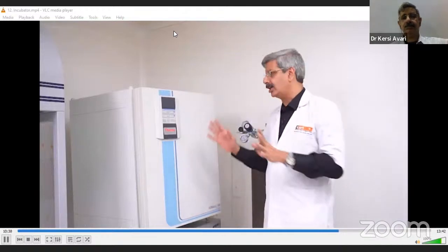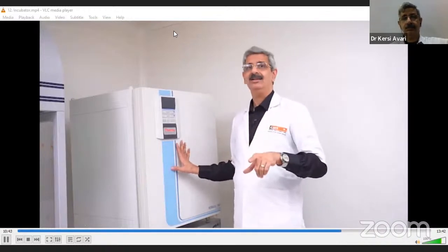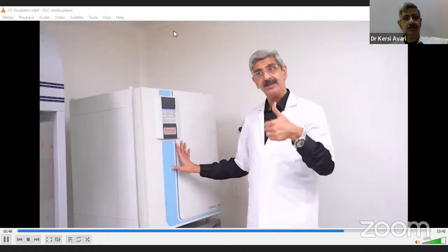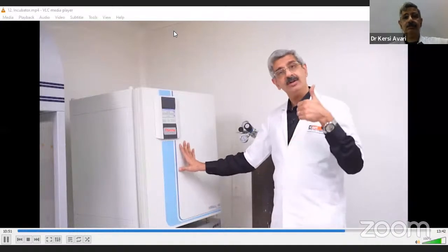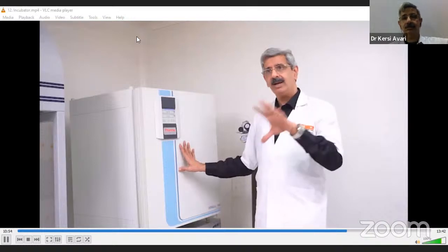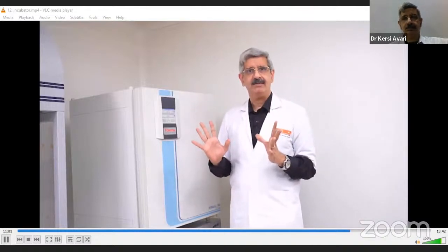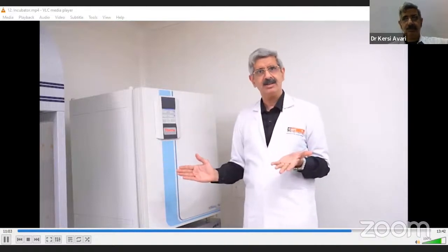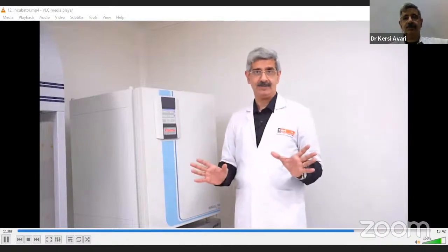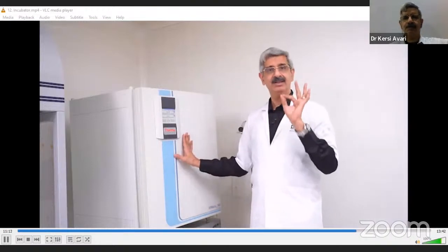Some people say, okay, I'll shut off the CO2. I will utilize a simple incubator, but still the temperature flux can have a toll on the sensors as such. Another thing that takes a toll is your electrical power surges. We don't mind power failures, but suddenly a power surge where your lights will suddenly glisten high, where the voltage and the wattage exceed its limit. So please, all these sensitive equipments should be there with a backup stabilizer. Usually they are strong, sturdy machines, but please handle them with care.